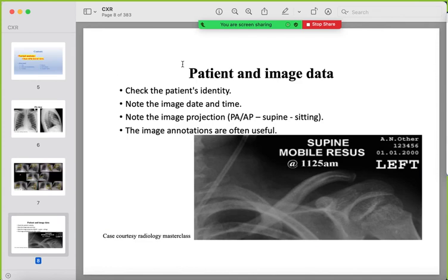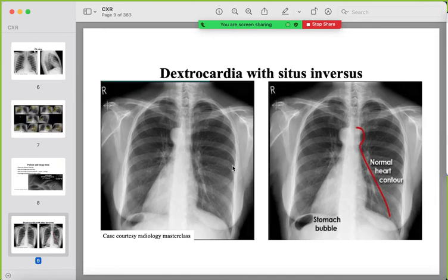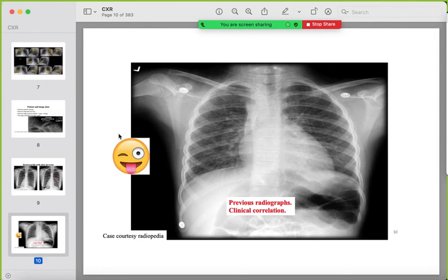First, you should start by checking patient and image data seen on the upper left corner of the image — such as the left side marker, AP projection, and other patient data. The importance of this is to detect any changes in situs. For example, if the right-side marker is present but the cardiac apex points right and the stomach air bubble is on the right, this is dextrocardia with situs inversus. Sometimes the film could be inverted. Any suspected dextrocardia should be confirmed by looking at previous radiographs and clinical correlation.